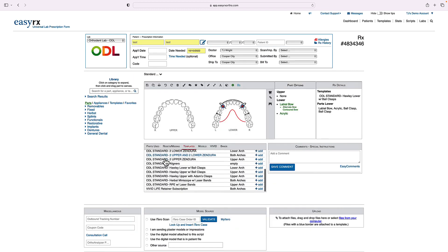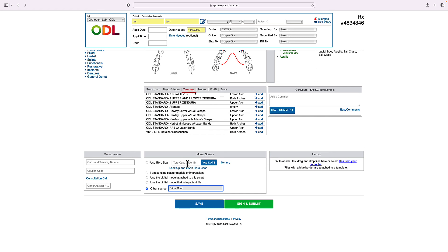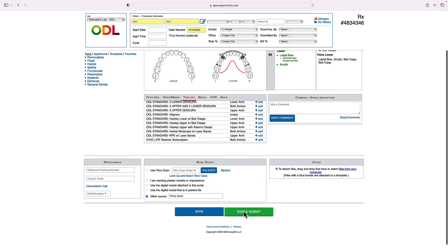Next step is I'm going to select the model. And I'm going to put prime scan, whatever your scanner is, select the model. If you use iTero, select that and link the case. If you're uploading the files, you can upload them here and sign and submit. Let's do it.